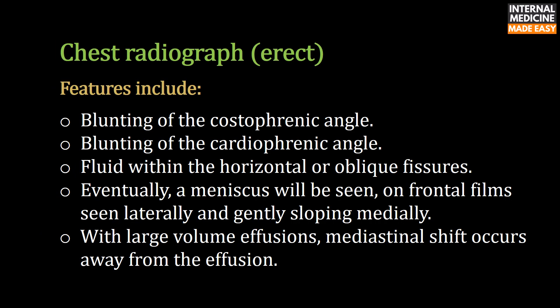Features on an erect chest radiograph include blunting of the costophrenic angle, blunting of the cardiophrenic angle, and fluid within the horizontal or oblique fissures. Eventually a meniscus will be seen, on frontal films appearing laterally and gently sloping medially. With large volume effusions, mediastinal shift occurs away from the effusion.